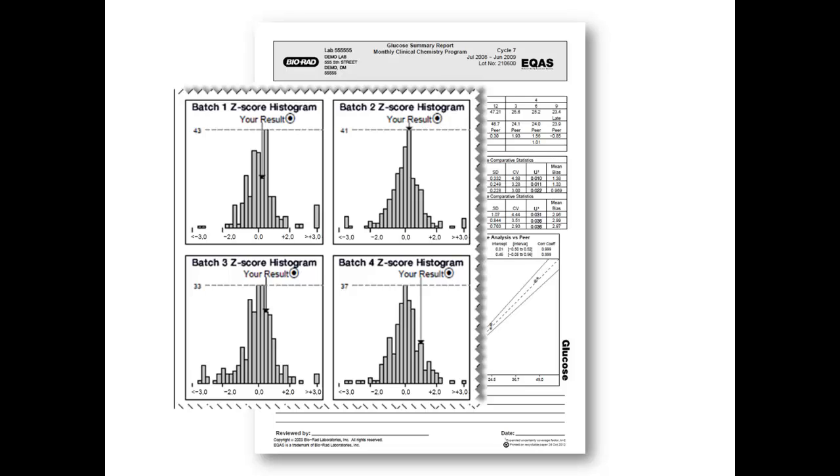You're compared to your peer if there are a minimum of 27 reported results for the batch. If less than 27 results are reported, your comparator will be the method. If less than 27 reported results are received for the method, you'll be compared to all results or mode.